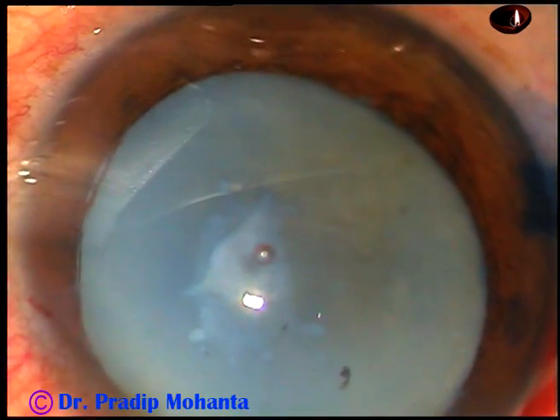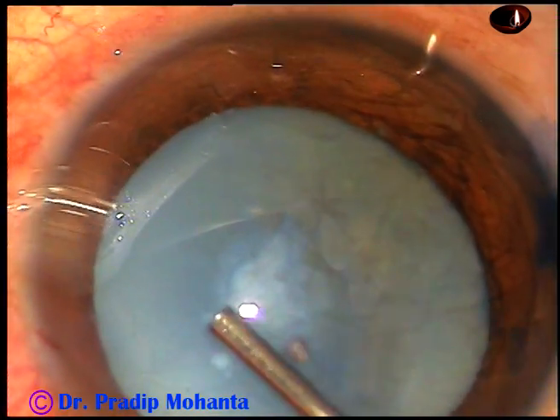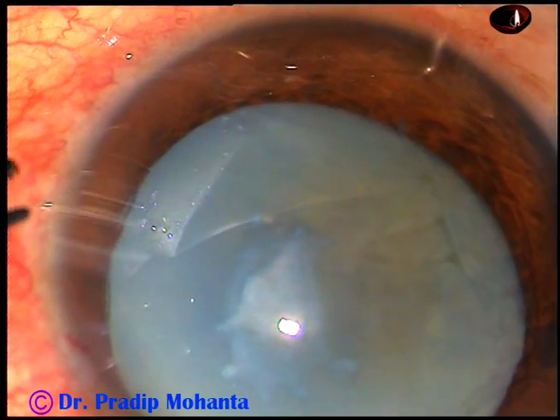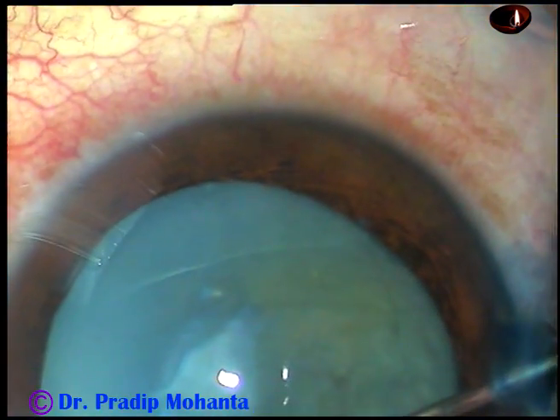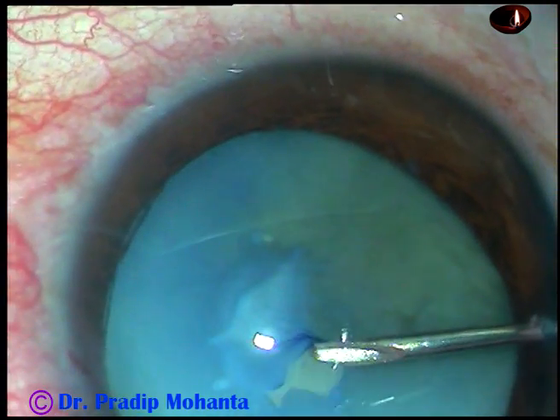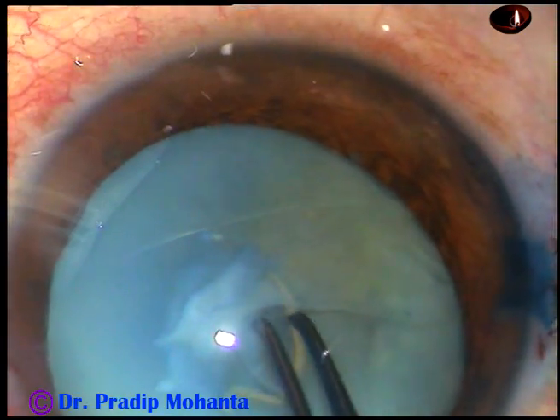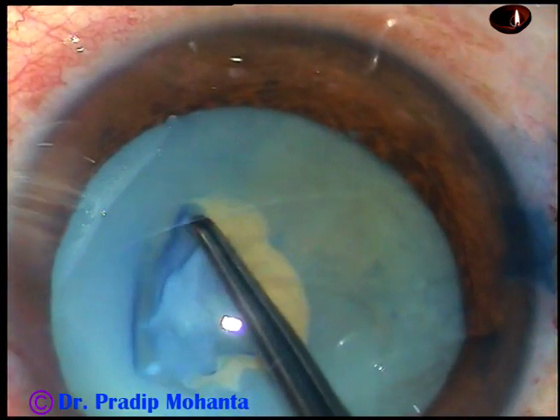Fortunately, this fibrous plaque is in the central area and I should be able to do a capsulorhexis around it. Let us see how the capsulorhexis goes. Viscoelastic substance is injected into the anterior chamber and the anterior chamber is filled up. Now a 26-gauge bent needle is taken and the capsule is cut just beside the fibrous plaque, superiorly. My idea is to do a spiral rhexis — a small rhexis around this plaque first, then do an adequate-sized rhexis.